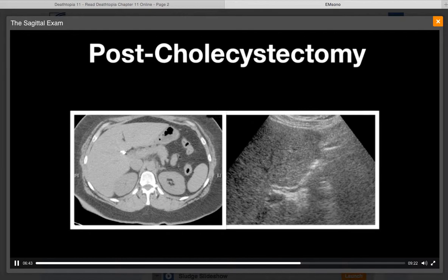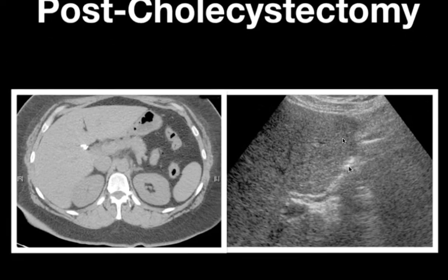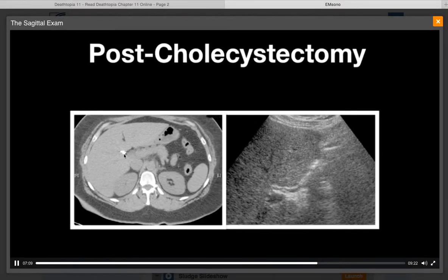In this patient with right upper quadrant pain, a focused gallbladder ultrasound was performed. You don't see the gallbladder at all. You've got, however, some echogenic foci with posterior shadowing right in this area here, and this is due to the presence of surgical clips. The CT scan that was ultimately performed on the patient demonstrates here surgical clips as well as surgical absence of the gallbladder.